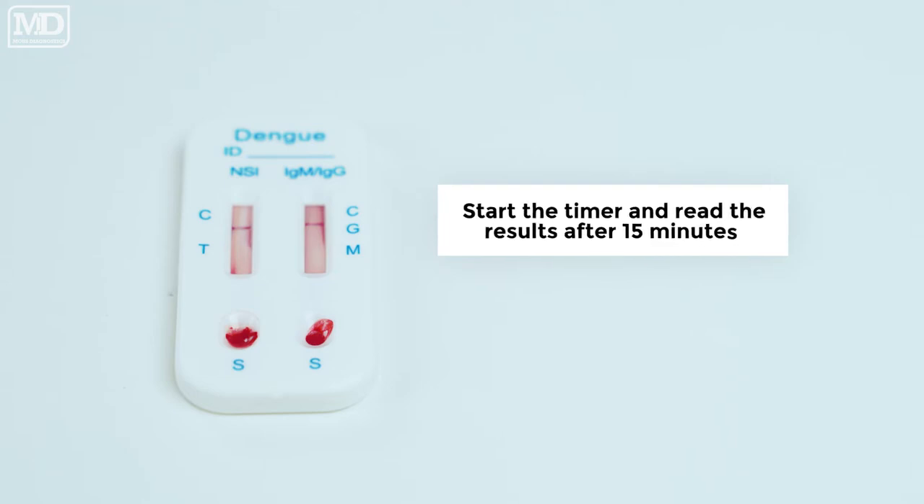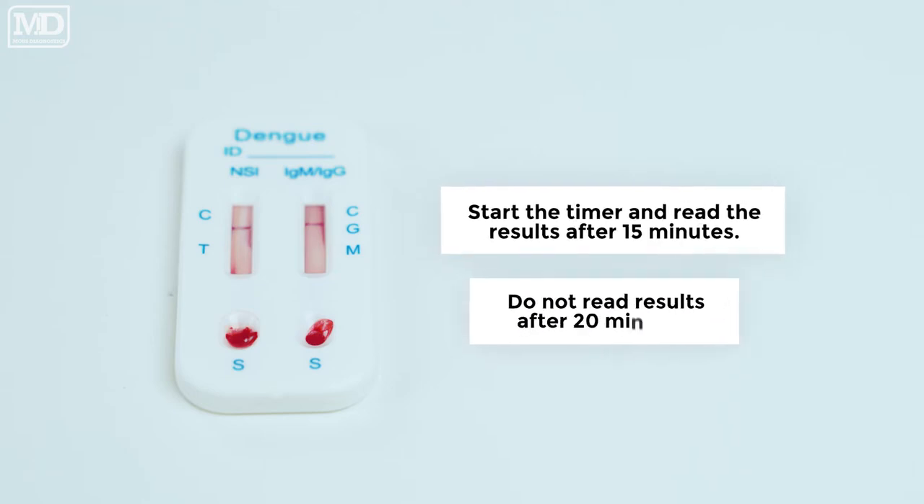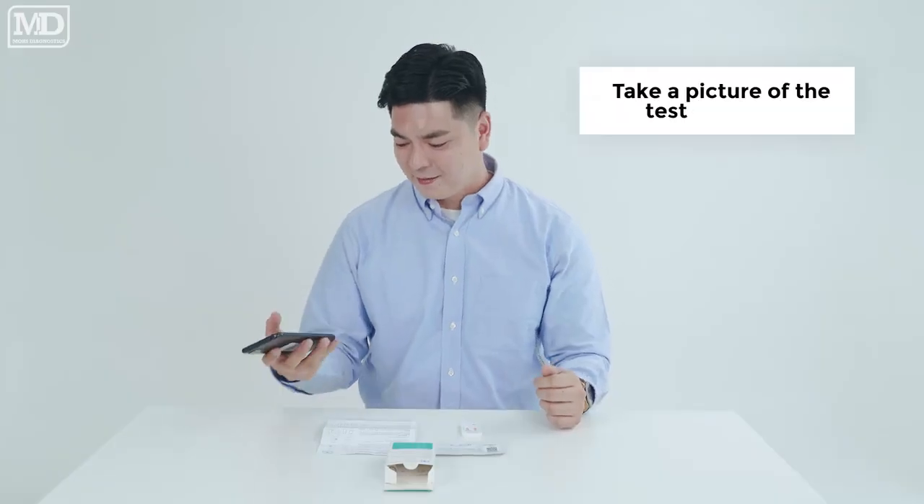Start the timer and read the results after 15 minutes. Do not read the results after 20 minutes. Take a picture of the test cartridge.